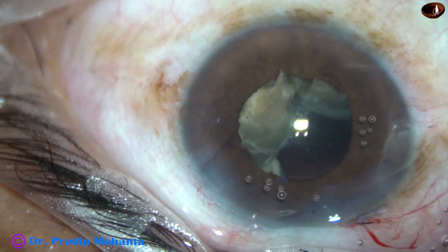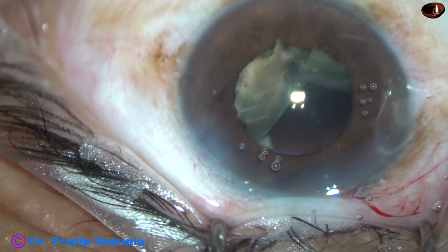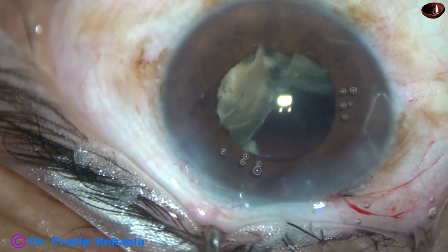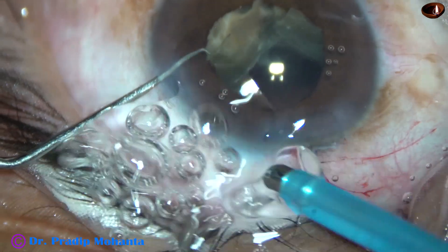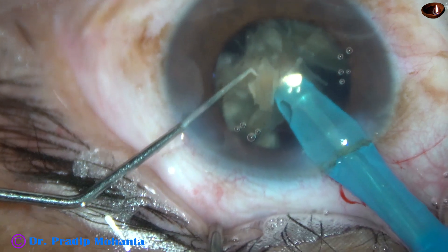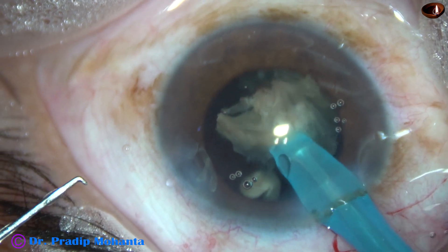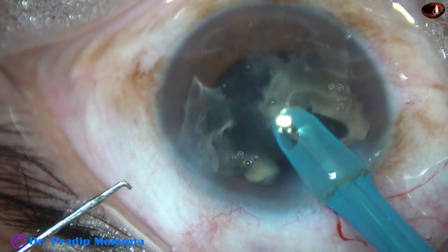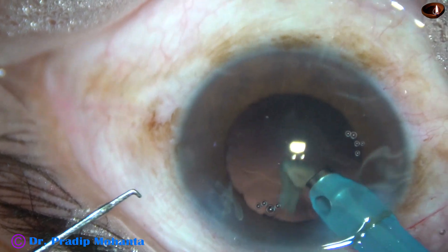It is positioned so that as I go inside, the larger piece is in front of the phaco needle. The pupil remained dilated for some time for managing these two large pieces. The pupil has dilated — this is because of reverse pupillary block at this time, and this reverse pupillary block is helping me in keeping the pupil dilated. I didn't do anything to release it, and see how beautifully the last pieces are getting emulsified.